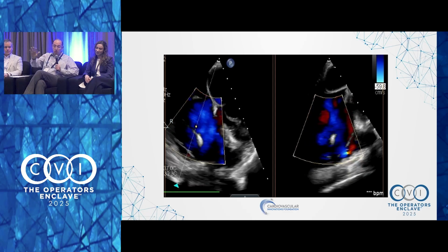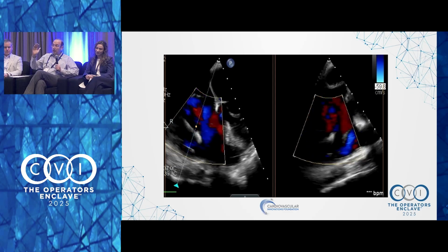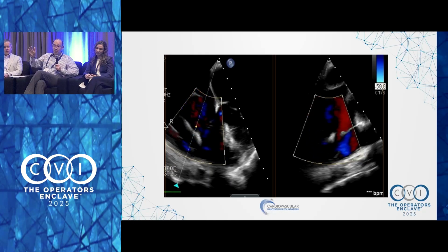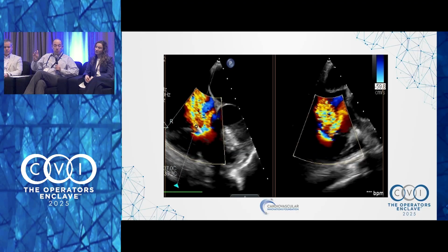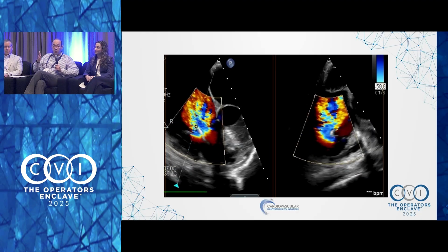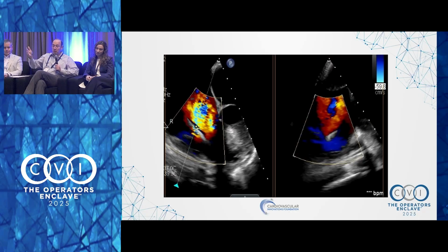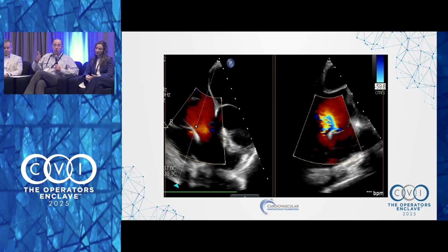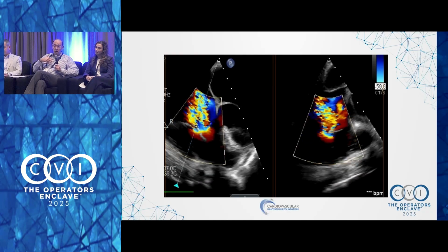Because automatically, if it's a new lead and the patient is pacer dependent, the lead can be removed and leadless pacing strategies adopted. We try not to move the lead to reduce TR. I think that is proven time after time, including by you, Paul, and Nadira and many others, that it doesn't change things. We remove it for the ease of the procedure. And in our practice, we stopped mucking with the lead.